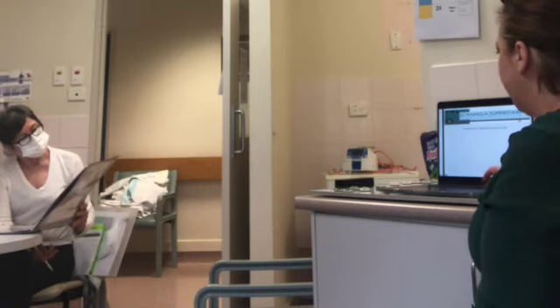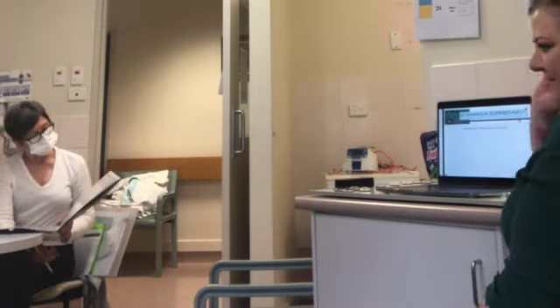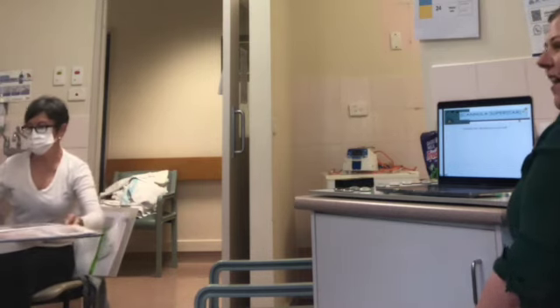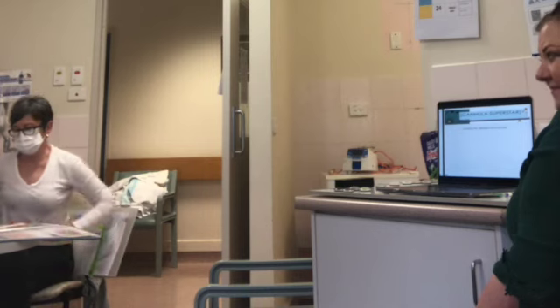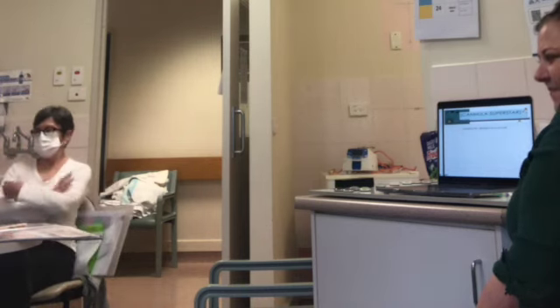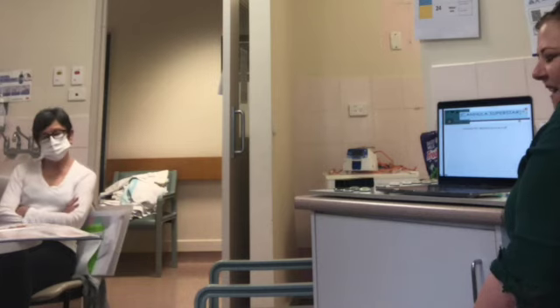So, cannula dressing changes, do we do it well? No. I've seen some. When we change them, we do. It's what happens when you come back the next day and see the tape that's been put over the bung or anything else. Oh my God, throw the bloody tape away.